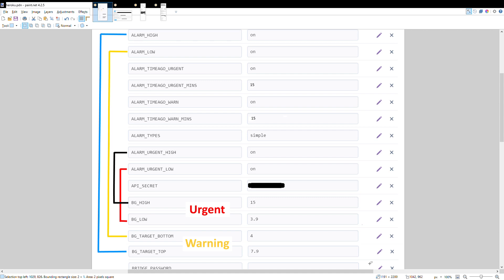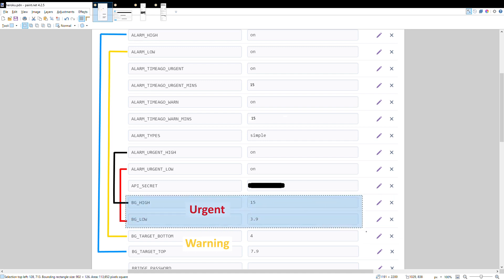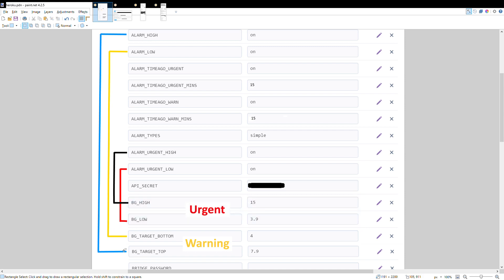For example, you might set it to 5 and 7.9, or a bit higher — it's a personal preference. The bg high and low refer to the urgent ranges: I've set above 15 as urgent high and below 3.9 as urgent low, but you can change these. The alarm urgent high refers to the blood glucose high, the alarm urgent low to the blood glucose low, bg target bottom refers to alarm low, and bg target top refers to alarm high.